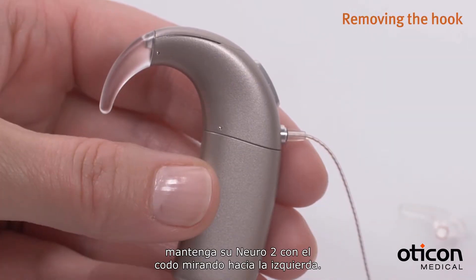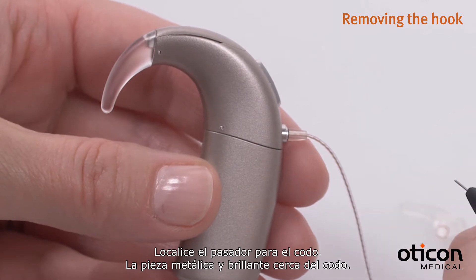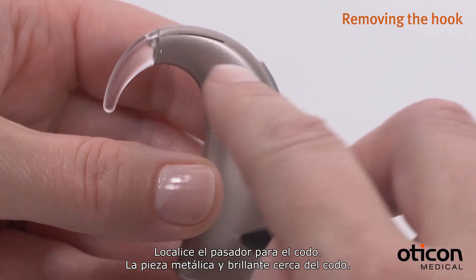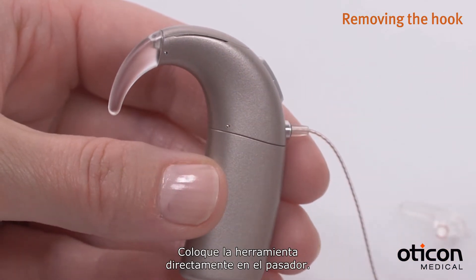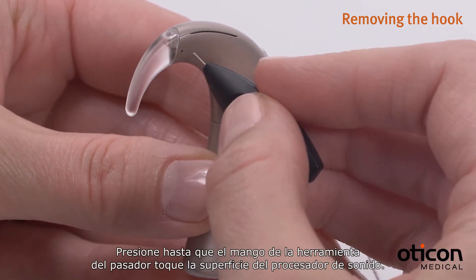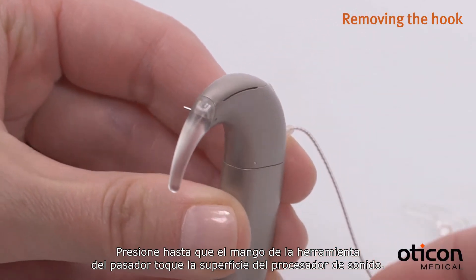Locate the hook pin. It looks like a small shiny dot near the hook. Place the pin tool directly on the pin, then press until the handle of the pin tool touches the surface of the sound processor.